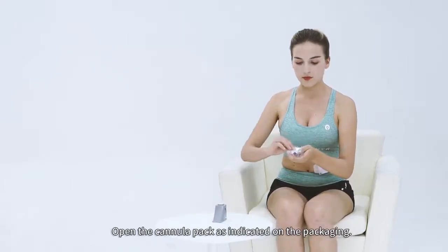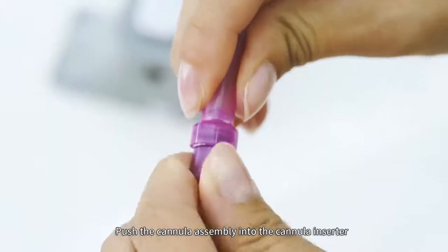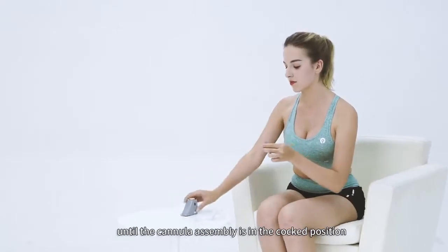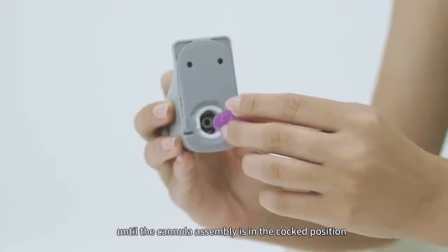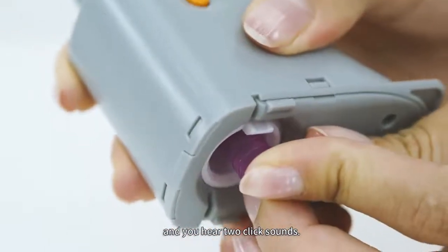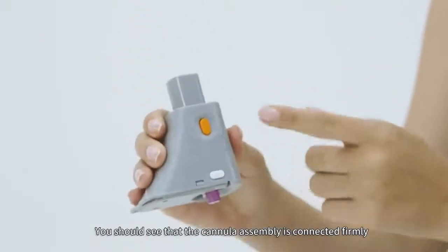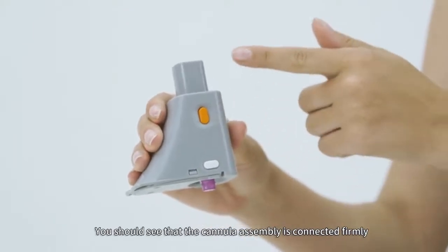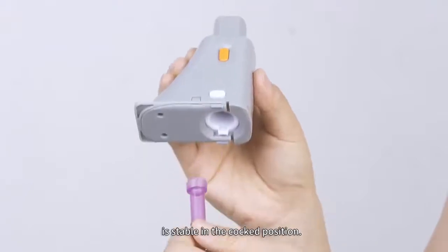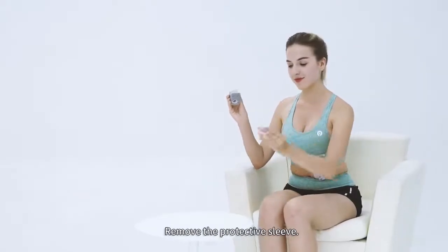Open the cannula pack as indicated on the packaging. Push the cannula assembly into the cannula inserter until the cannula assembly is in the cocked position and you hear 2 click sounds. You should see that the cannula assembly is connected firmly to the inserter and the inserter is stable in the cocked position. Remove the protective sleeve.